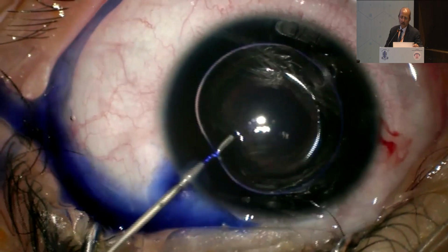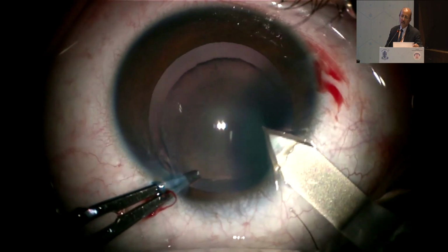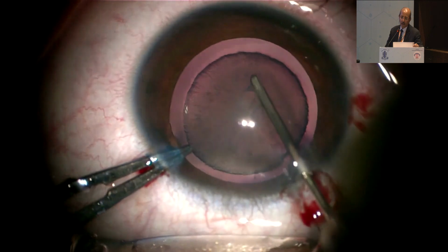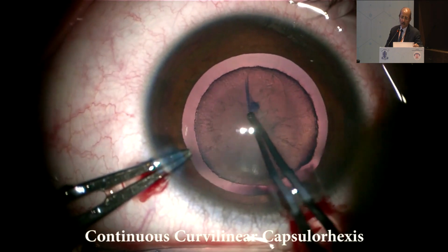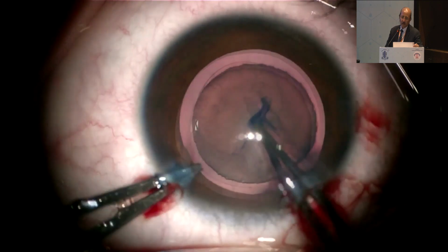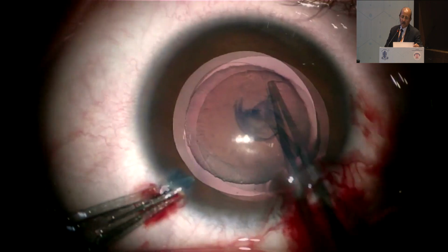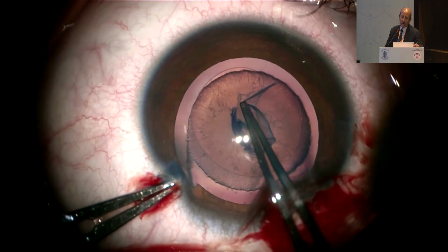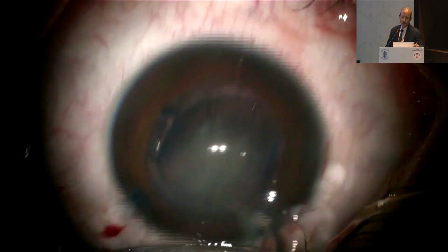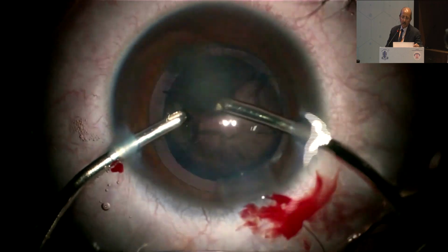classical zonular cataract. To demonstrate, stain the anterior lens capsule with trypan blue dye and make a continuous curvilinear capsulorhexis. The size of the capsulorhexis is kept around 5 millimeters or so. If you try to make it large, it will be very large. So make a precise capsulorhexis of about 5 to 5.5 millimeters.